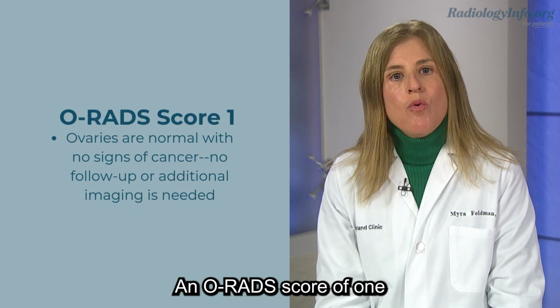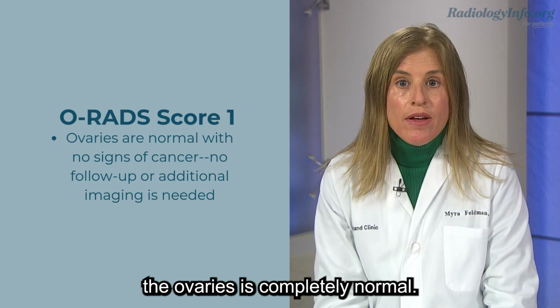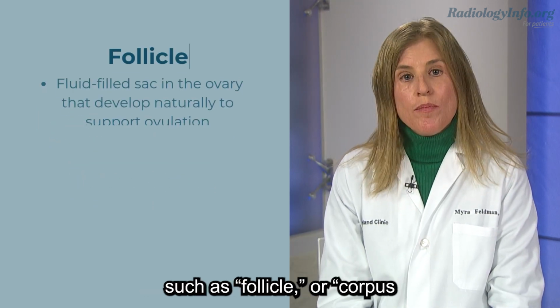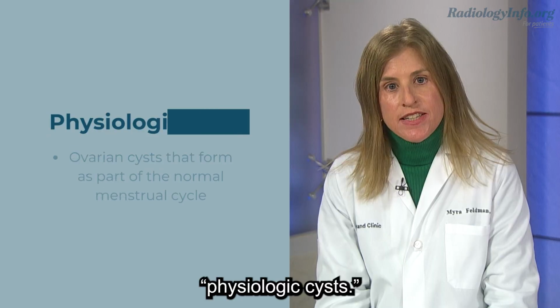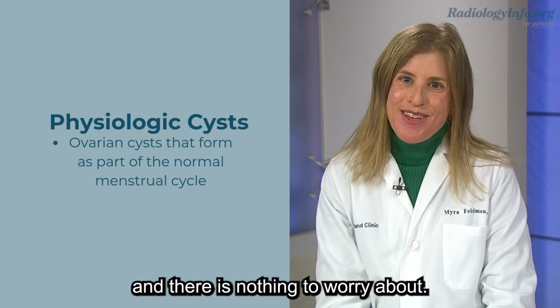An O-RADS score of 1 means what is seen in and around the ovaries is completely normal. Nothing more needs to be done. Occasionally, words such as follicle or corpus luteum may be used in the report. These are all part of the egg production process and what we call physiologic cysts. These simply indicate your ovaries are doing their job, and there's nothing to worry about.